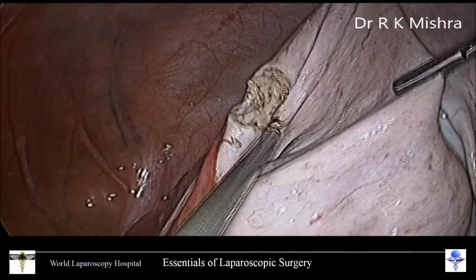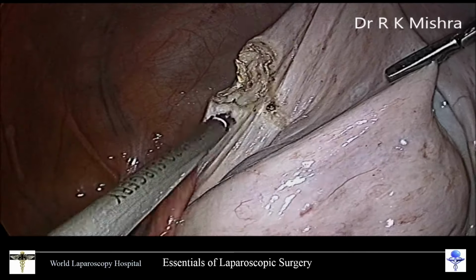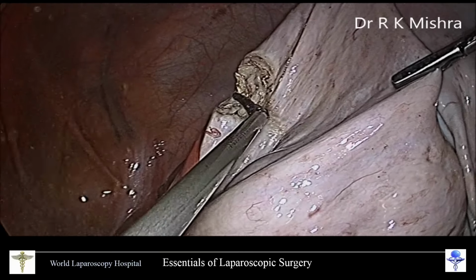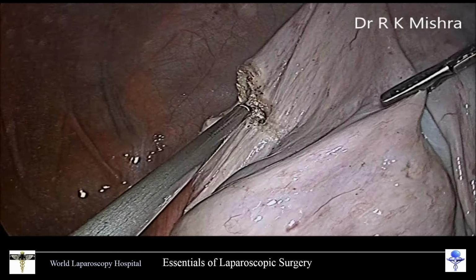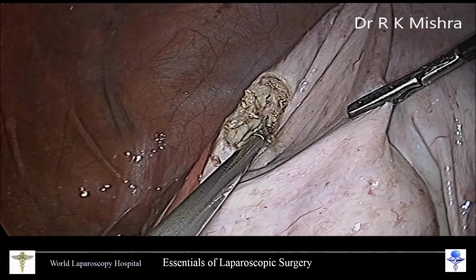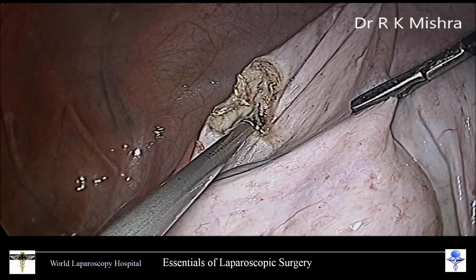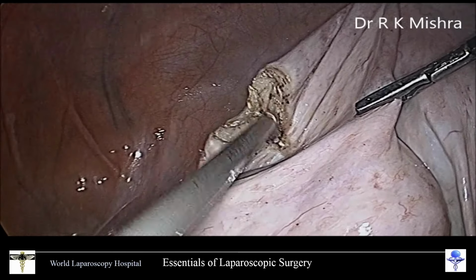But of course, if you can manage ovarian cystectomy, you can do it, especially if the cyst is outside the surface of the ovary. But sometimes, once it develops from within the ovary, it is even impossible to identify where the real ovarian cortex was. So in those situations, oophorectomy is the better option.